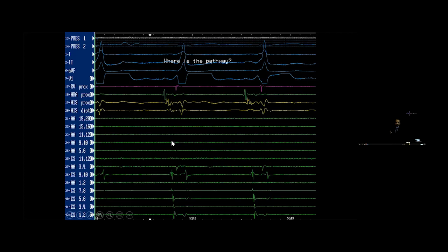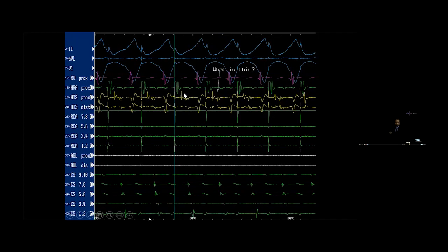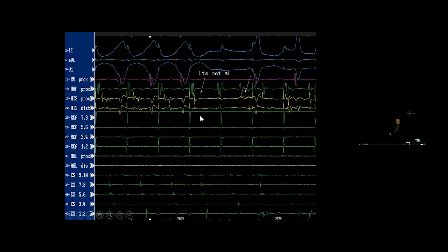I think that's the key first clue that we need to find out what is our signal of interest. In other words, if we pace and produce maximal pre-excitation, if we took the ventricular electrogram as we usually do as the signal of interest, we would completely ignore this location. But if the signal of interest is hiding somewhere here, the true early V, the pathway signal, then this is absolutely a site that we would be interested in. How to figure that out?